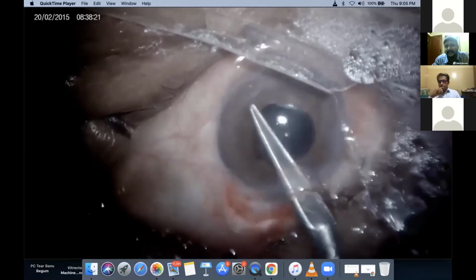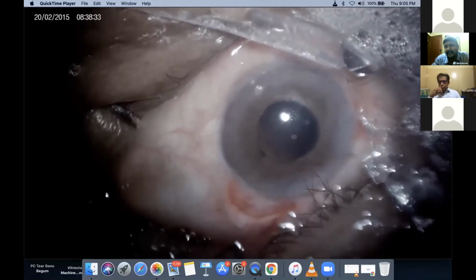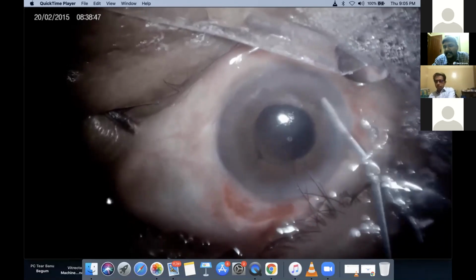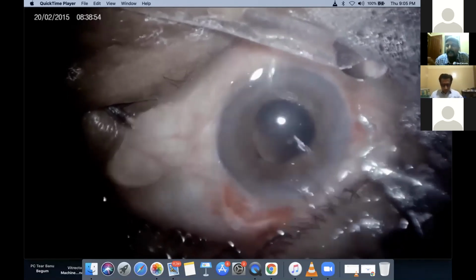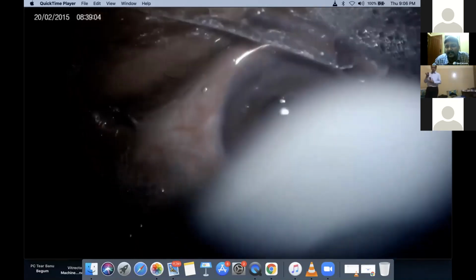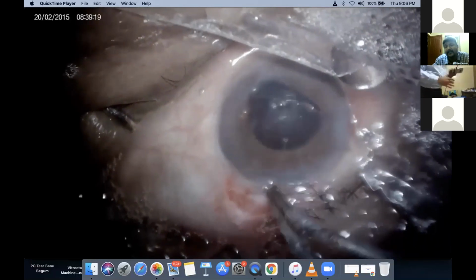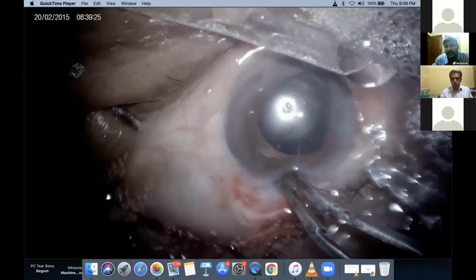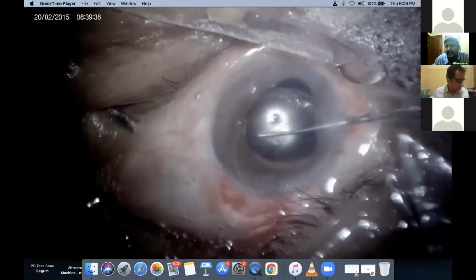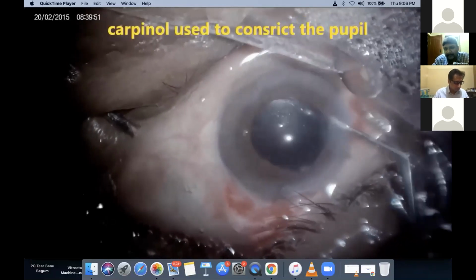So once I was sure that the vitreous is all gone, that is when I decided to place the IOL in the sulcus. I had a good rim of anterior capsule there, so the IOL was placed in the sulcus. What should be noted is the angulation with which we put the IOL is what makes it go exactly in the sulcus. Earlier, there was an angulation which made the IOL go into the bag.